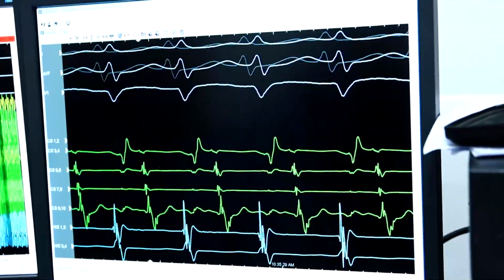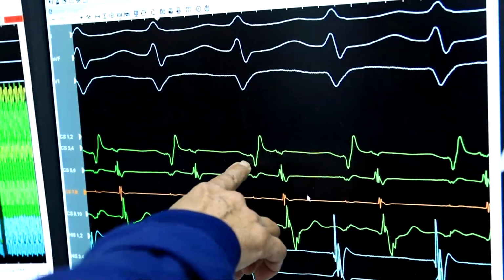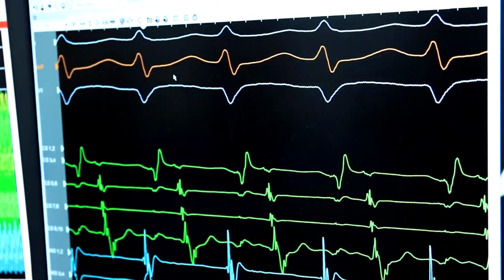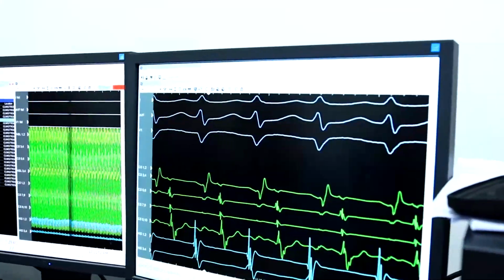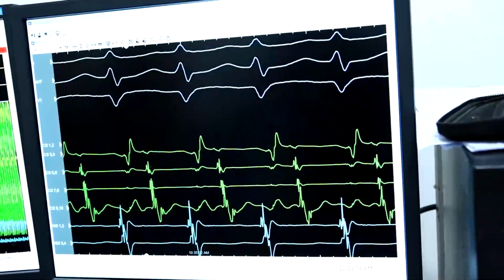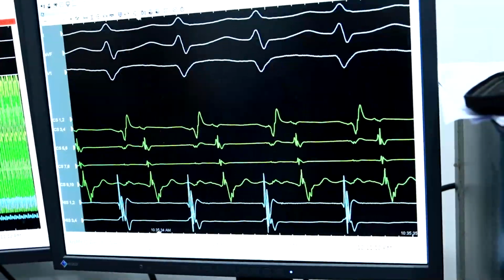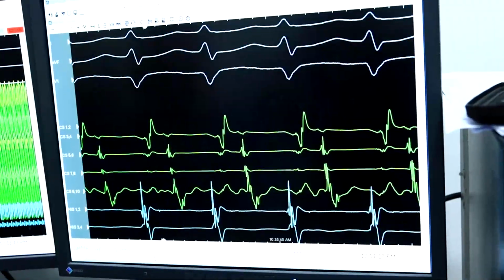What is seen here is that the retrograde atrial electrogram in the CS catheter is early in the distal CS. So we said maybe this is an accessory pathway on the left side, so we might have two tachycardias, AVNRT and a concealed left lateral accessory pathway. So we tried to entrain the second tachycardia from the RV apex, and actually we had a VA dissociation.